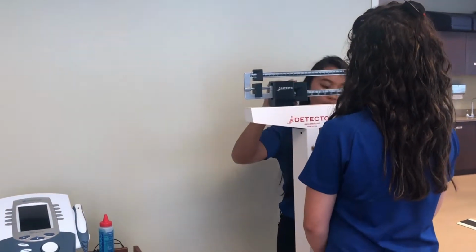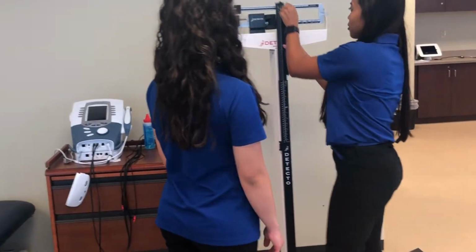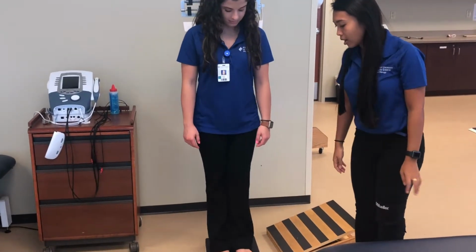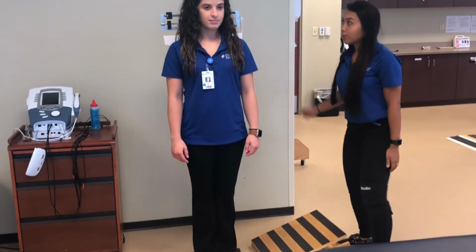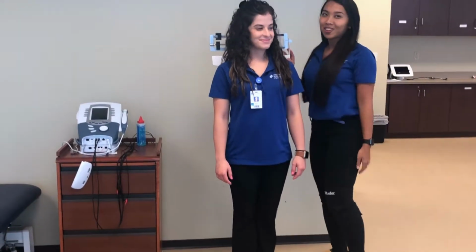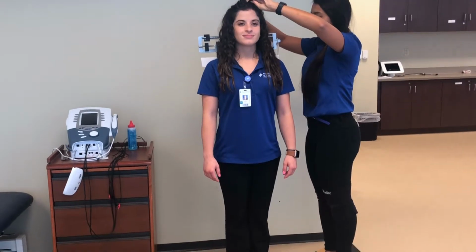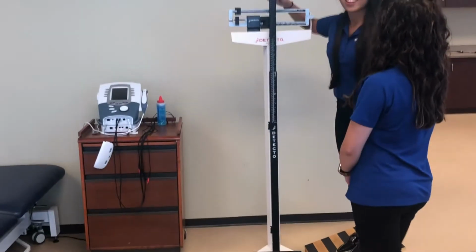And Ariana, you can take a step off the scale for me. Okay? And now I'm going to have you step back on the scale facing the window. And I'm going to ask you to keep your heels together and have your feet at about a 60-degree angle. Shoulders relaxed, arms to her side. And if your patient is a bit taller than you, you can use a stool, because you don't want to hit their head with the lever. So Ariana, I'm going to ask you to take a deep breath in. Okay, and you can take a step off. And she is 4'11 and a half.